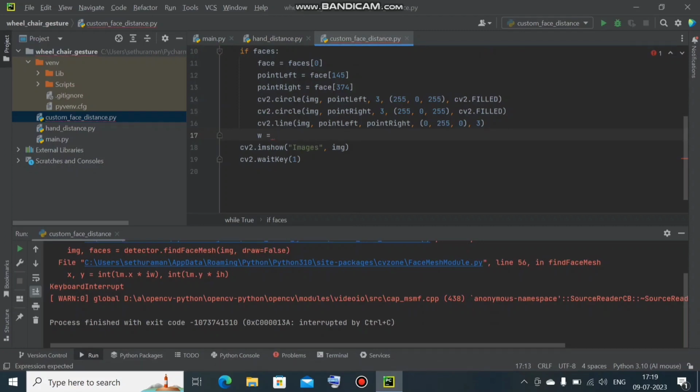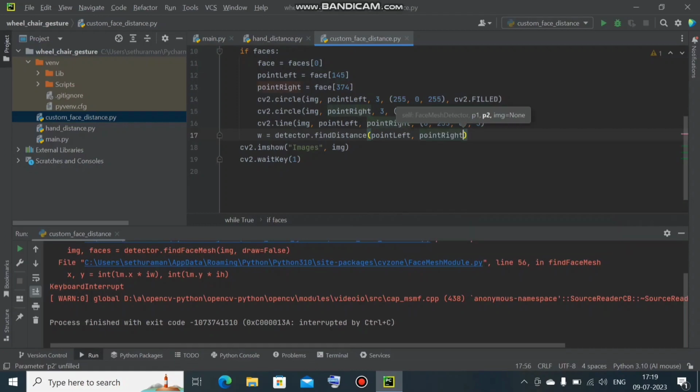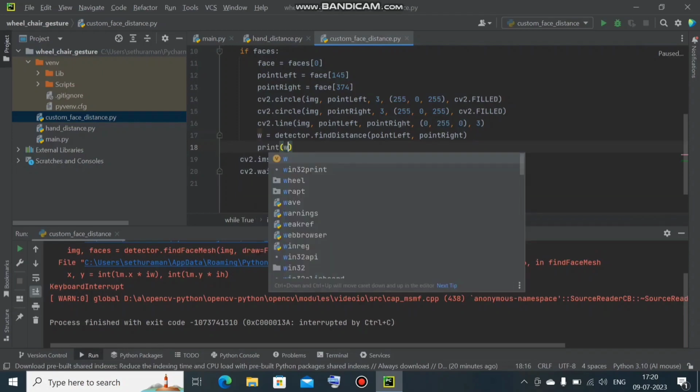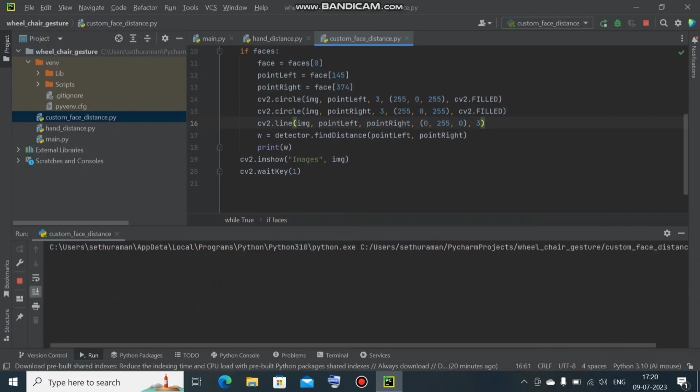The small w is the variable I'm going to assign to find the distance of the 2 points. Let us call detector.findDistance with point left and point right. We need to mention 2 points. What are the 2 points we need to find the distance between? Point left and point right. Then print w. Let us try this. In this case, when we go forward it will increase, and going backward it will decrease.